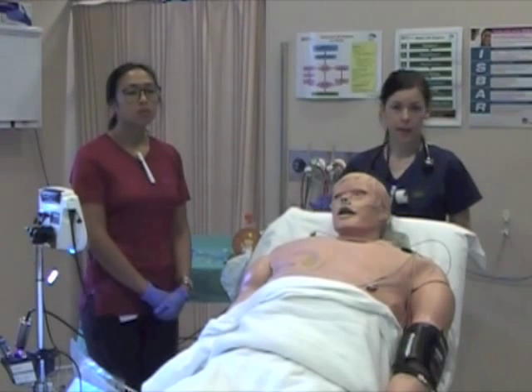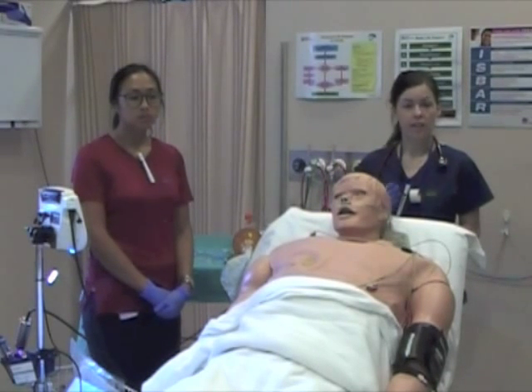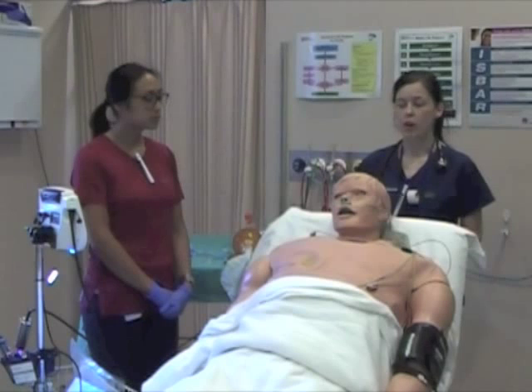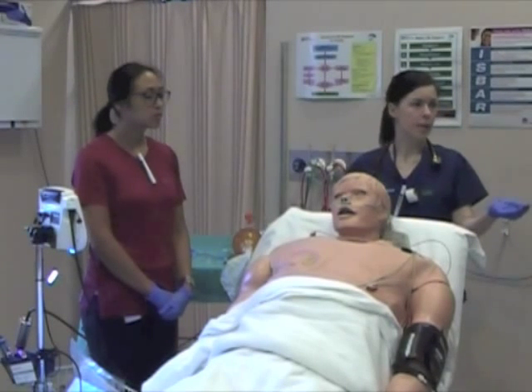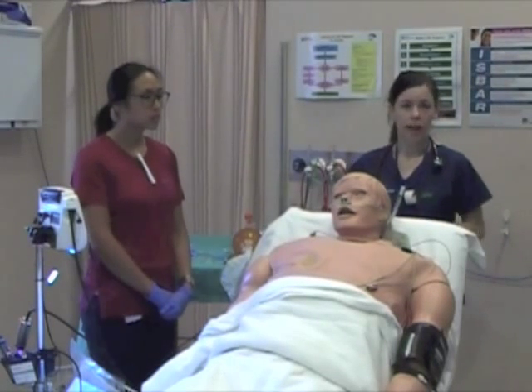In terms of our airway plan, our A is going to be a video laryngoscope with a size 3 MAC blade, an introducer, our size 7.5 ETT, and suction obviously ready. Our plan B is again the video laryngoscope, but also with additional airway maneuvers, so BURP, which our procedural nurse is going to help us out with. Our plan C is an LMA size 5, and our plan D is a surgical airway, and we'll prepare for that during the pre-oxygenation period by marking his neck as well.